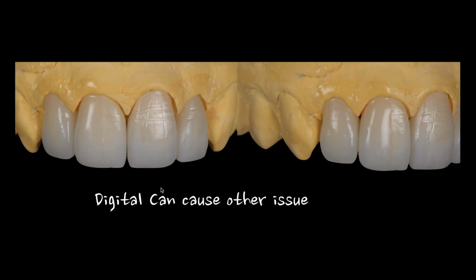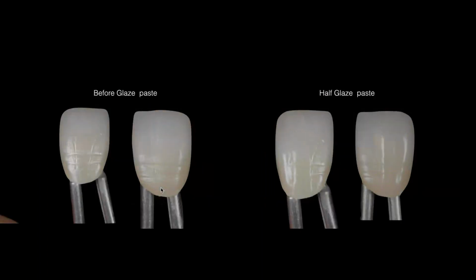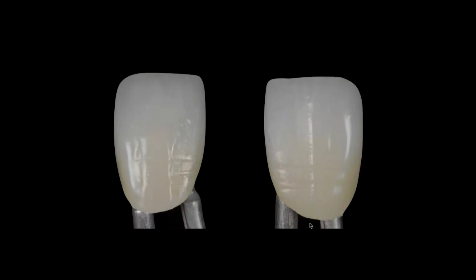The other problem is the next thing we're going to do is we're going to use a glazing paste on these. Because we're using glazing paste, because there's no fluorescence in the restoration, well, the glazing paste has a thickness to it. And when you apply that glazing paste on, here it is before, and here it is with glazing paste over half the tooth. And you notice how that topography that kind of looked horrible here doesn't look so bad here anymore, right? Because the glazing paste is actually filling in some of those areas.